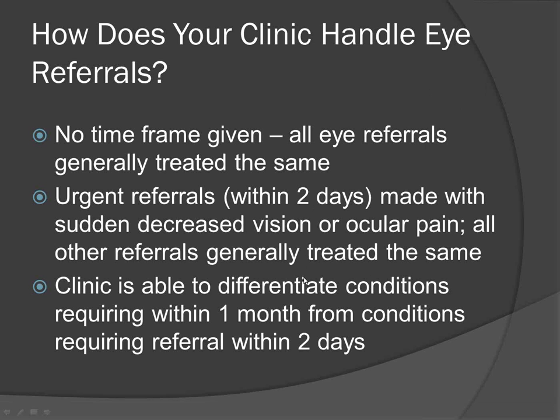This is Michelle from Brawley Clinic. Normally, if the provider says that the patient needs a retinal scan, then right after they're seen, they're sent to have the retinal scan.